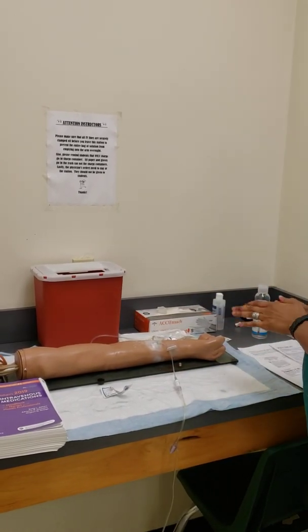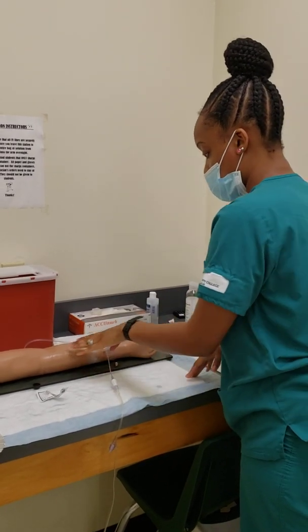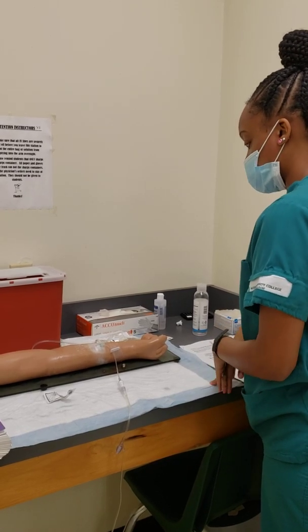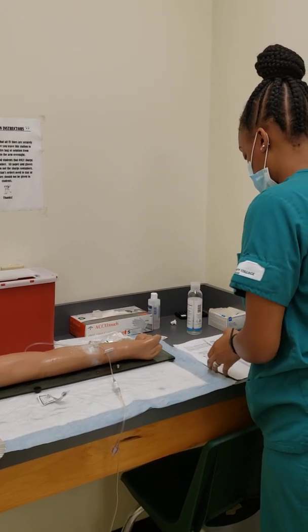So my patient doesn't have any redness or inflammation or anything. Her IV site is intact. Are you having any pain on a scale of 0 to 10? She says no. Okay, her bed is in the lowest position. Call light is in reach. I will leave the room, document, and report.